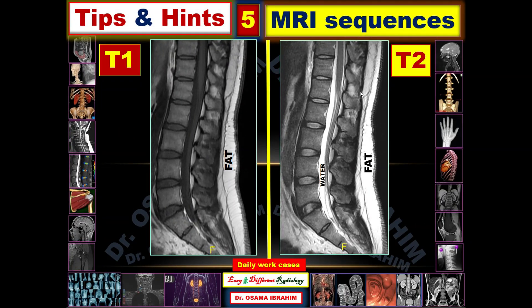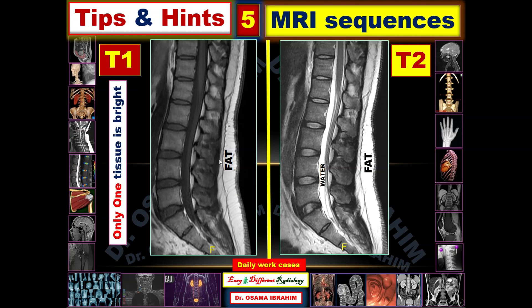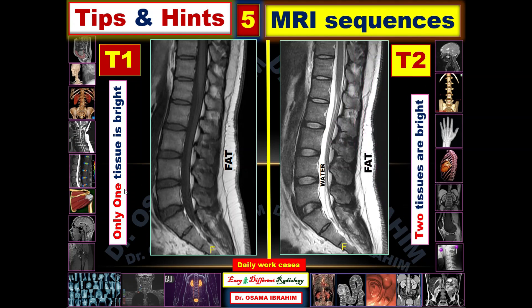Looking at these two MRI sagittal views of the lumbosacral spine, you can easily discriminate T1 from T2. In T1, there is one type of tissue appearing bright: fat, which appears bright in the subcutaneous regions, epidural spaces, and bone marrow within the vertebral bodies. In T2, two tissues appear bright: water in the CSF canal and fat. Water also appears bright within the nucleus pulposus of the intervertebral discs. So T1 has only one bright tissue, while T2 has two.